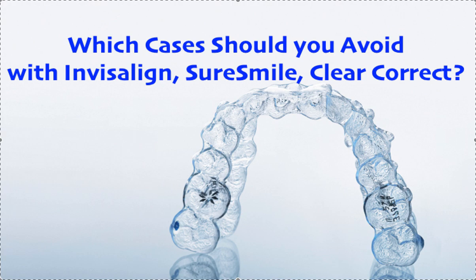What else? That's pretty much the big posterior crossbites. No posterior crossbites in adults. You can take them and you can leave it and you can program it to leave it, but you need to make sure the patient knows that you're not fixing that part, which means certain types of paperwork, which is not coming from Invisalign. You need to know where this paperwork is.